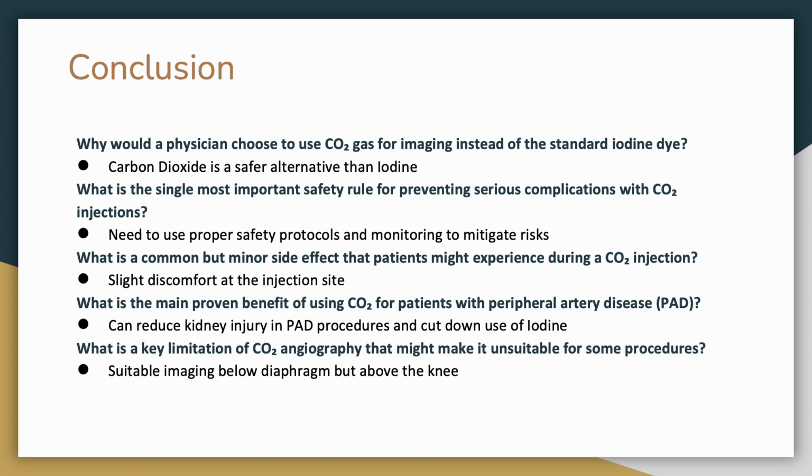Using carbon dioxide as a default for most cases where iodine isn't needed would benefit the industry from both a risk and a resource perspective. So in conclusion, some questions could be answered. Why would a physician choose to use carbon dioxide gas for imaging instead of standard iodine dye? That would be because carbon dioxide is a safer alternative than iodine.